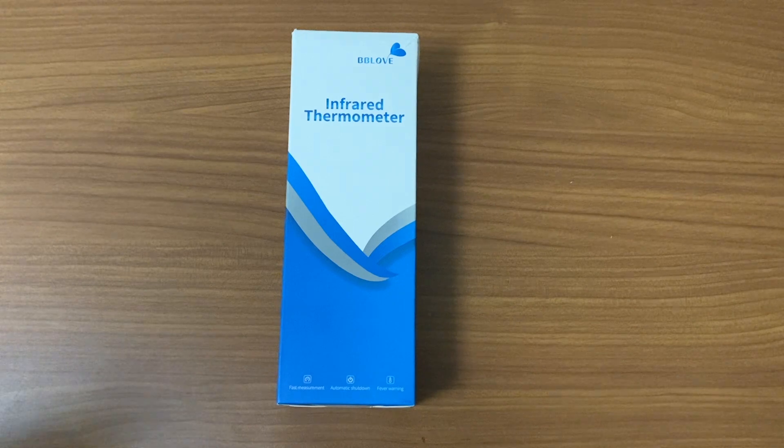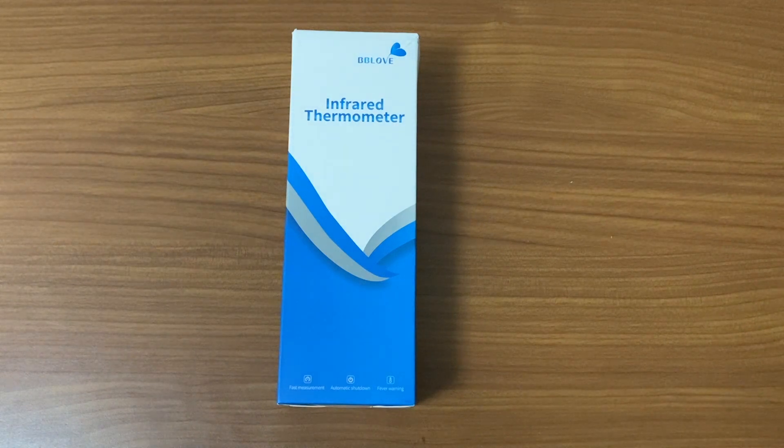Hey guys, welcome to Aaron's Review. In today's video we have an unboxing of a BB Love infrared thermometer. This channel is mostly about gadgets — mainly monitors and players — but this is a side change. I was tasked to buy a new infrared thermometer, went shopping yesterday, saw this one that everybody was crowding over, so I bought it. This is a quick demonstration of how to use it and a bit of discussion on how to use one correctly.